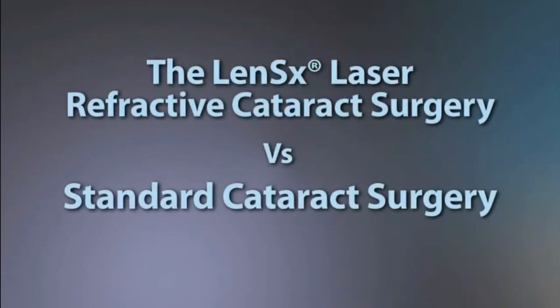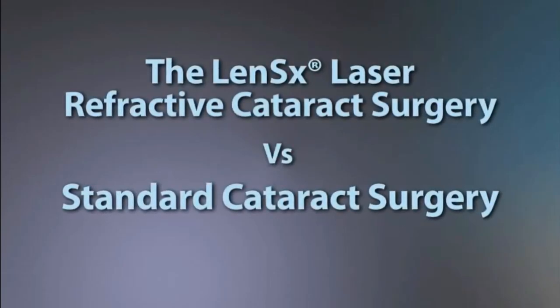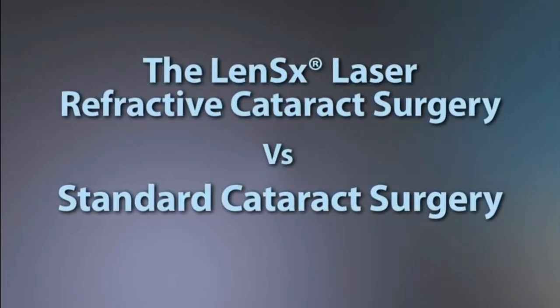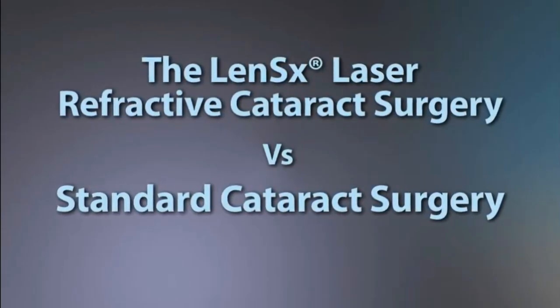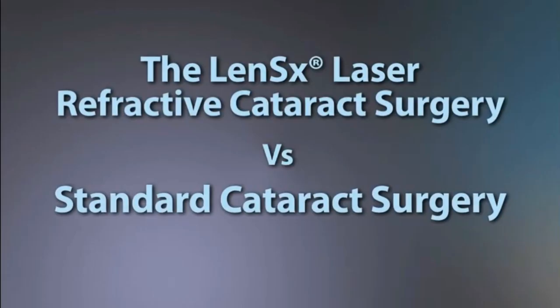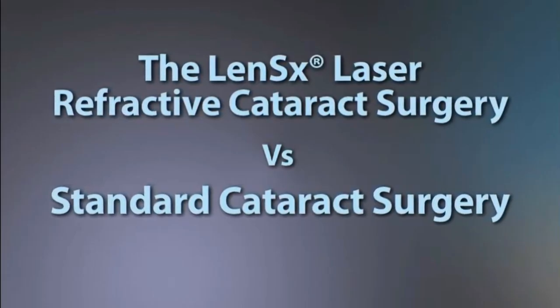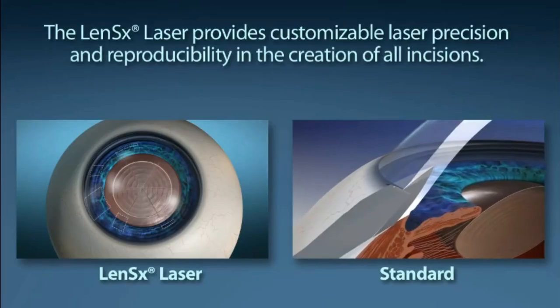So cataract surgery can be performed as a standard cataract surgery or a refractive cataract surgery. Refractive cataract surgery means apart from removing the cataract, we try to remove the full number as much as possible. The first difference is the incisions.